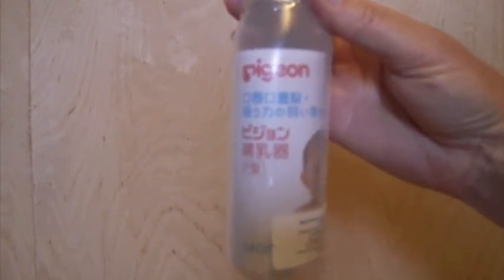This is a Pigeon bottle. It's a Japanese bottle specifically designed for babies to nurse with cleft palate. It's available through Children's Medical Ventures on their website at www.childmed.com, and that's the only vendor we're aware of in the United States.